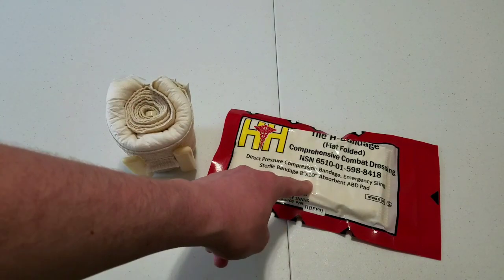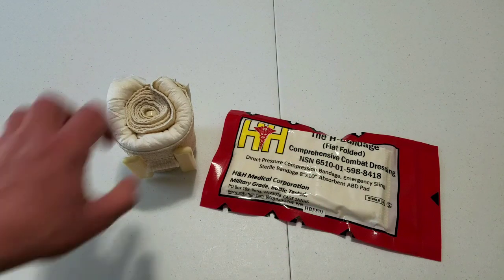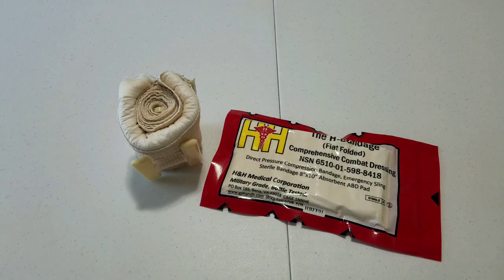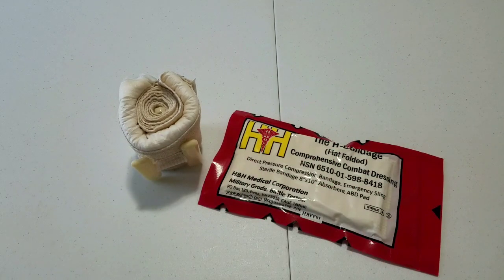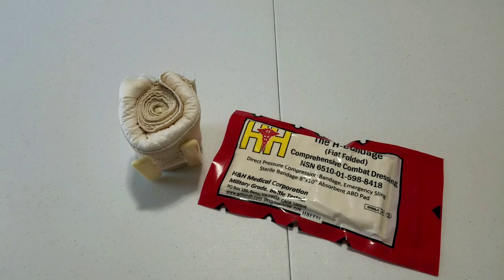You can see the pad is 8x10 on the standard size. It comes in two sizes: the standard, which is a 4-inch wrap with an 8x10 pad, and what they call the thin, which is a 4-inch bandage with a 4-inch pad. The major difference is how much surface area it can cover, and the size of the package. They both come in flat or rolled packaging depending on where you want to put it in your kit.